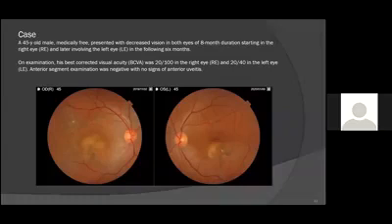Can OCTA replace indocyanine green regarding choroidal circulation? Yes. Swept-source OCT will be very helpful for you in some cases, but not in all cases. For example, in cases of Vogt-Koyanagi-Harada, if you have no access to ICG, you can use swept-source OCT to look at the choroid.